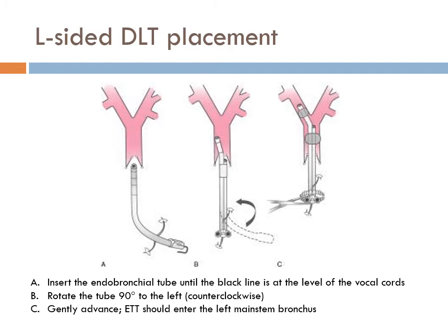The other way to do things is to put a bronchoscope down. So the cuff is up, I put my bronchoscope down, and I can do it one of two ways. This is the tracheal hole. You guys notice when I went around that this is the tracheal hole and that's the bronchial. So you can go down the tracheal hole, and now my scope is right here, and I'm watching that bronchial tip, and I can see that tip as I pass the scope into the left side.